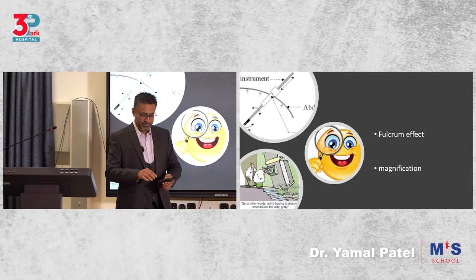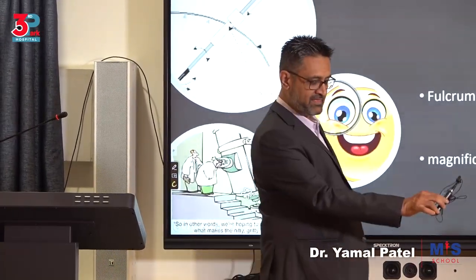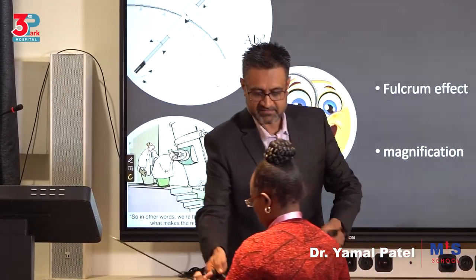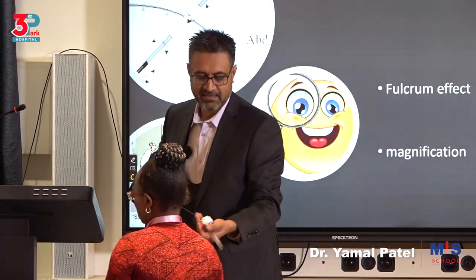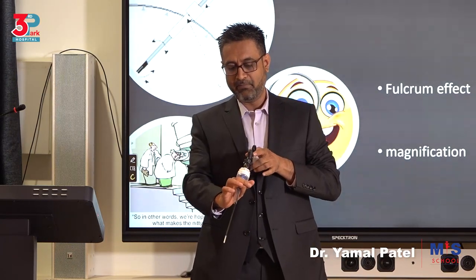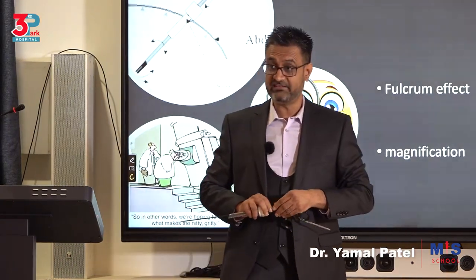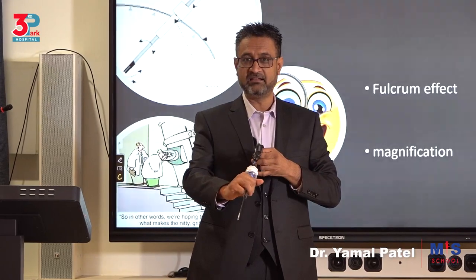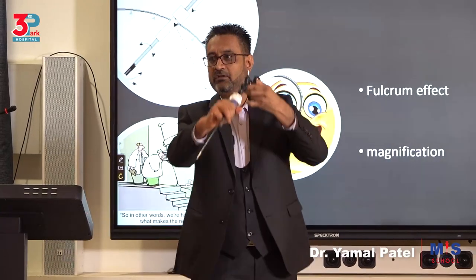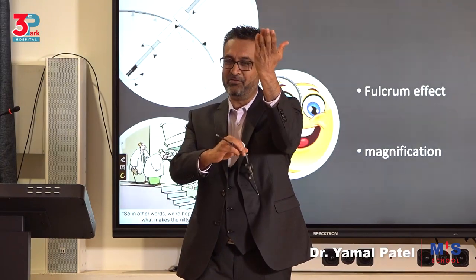Fulcrum effect. When I'm doing an open surgery, if I want to move this from here to here, I have to move it like that. The same direction. In laparoscopy, I have a fulcrum at the abdomen cavity. So if I want to move it up, my hand cannot, because you'll realize that's something you might start doing. Everybody initially does that. I tell my assistant, move the uterus up, and the hand goes up immediately, because that's what they want to do. But actually, it has to go down to move the uterus up. You understand what I'm saying?